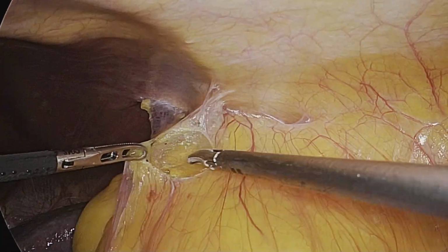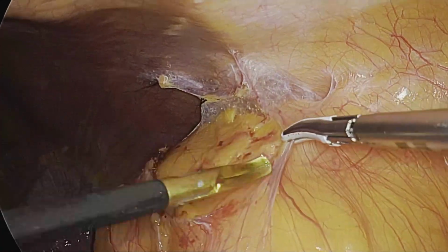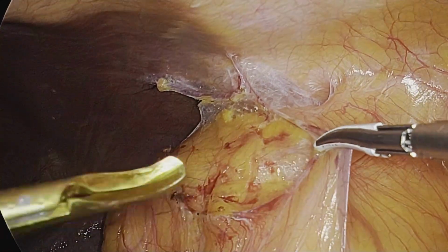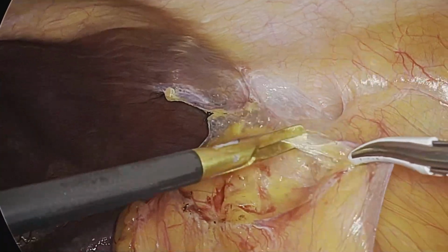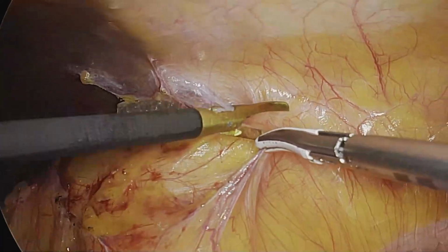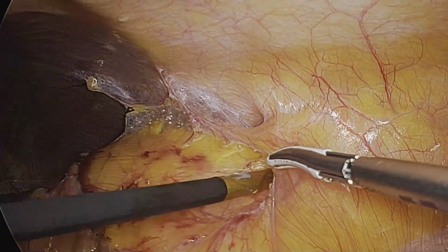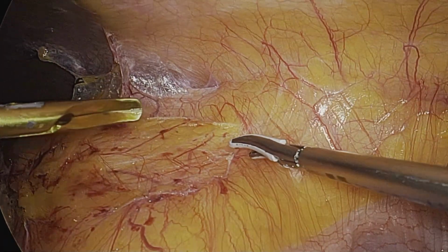It is of particular importance that Gerota's fascia should not be opened in a case of radical nephrectomy, and this avascular plane should be kept in its entirety. Here, the plane is being developed, and the dissection will proceed just between the mesocolic fat and the Gerota's fascia.